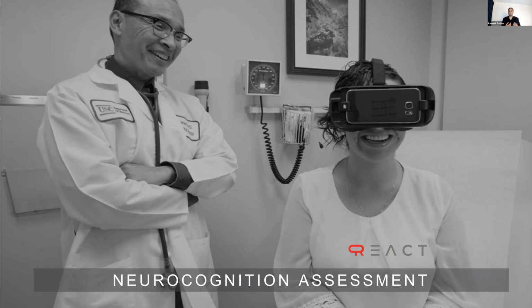So in that sense, virtual and augmented reality is not only a display device, but also a capture device, because the sensors and cameras and gyros in the head-mounted device are also capturing information about the person who's wearing it.